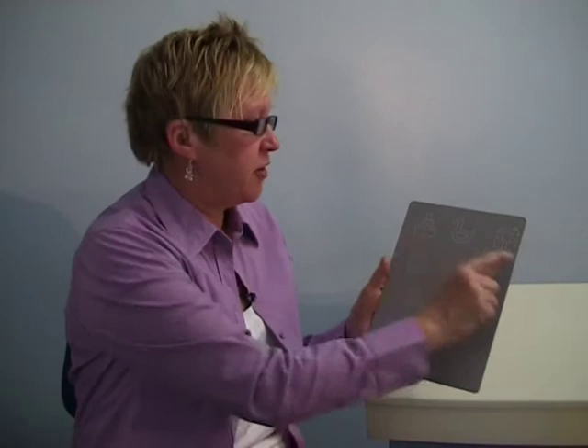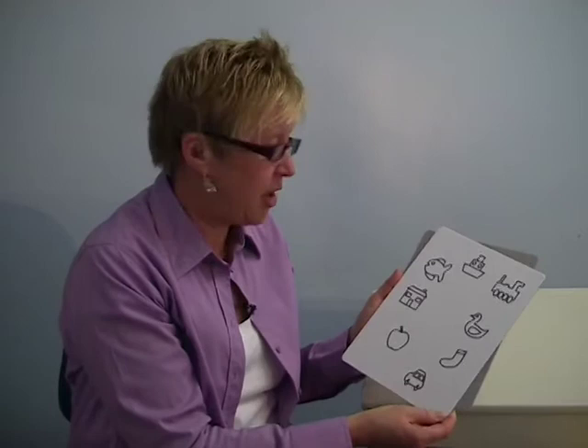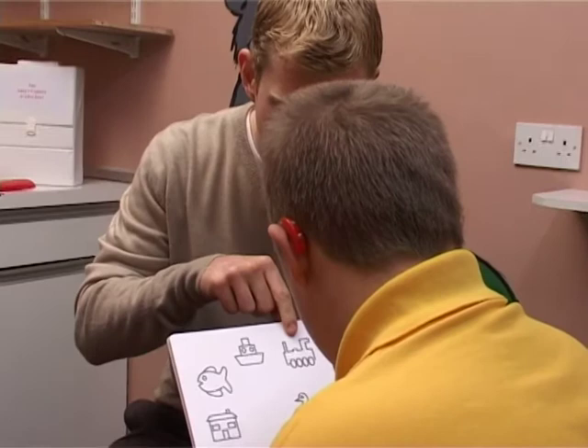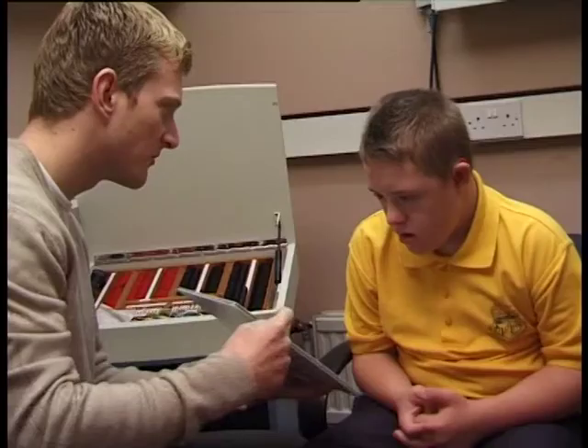The Cardiff near test uses the same design principle as the acuity test, but this time it is not a preferential looking test — we want the child to name, match, or sign the pictures in a similar way to a conventional near vision test. We have a matching card so we can begin by asking the child to name, match, or sign the pictures to be sure they're able to do the test. This way we know before the test exactly what the child is going to call each of the pictures.